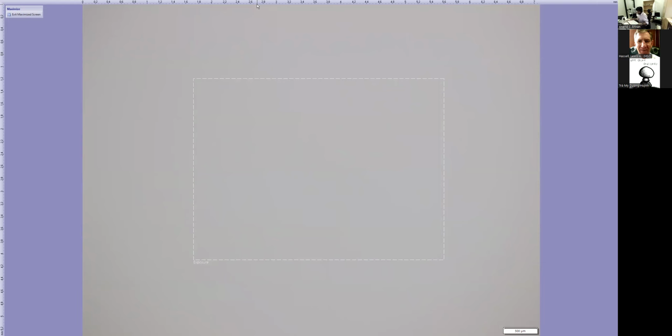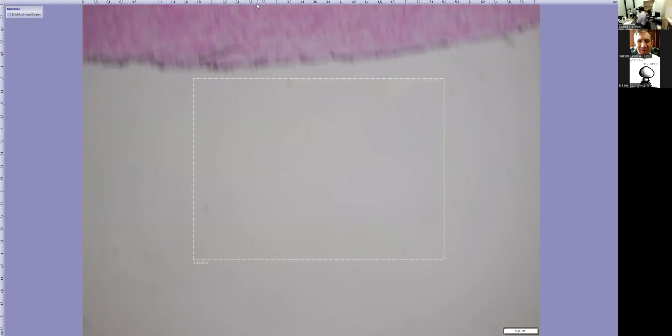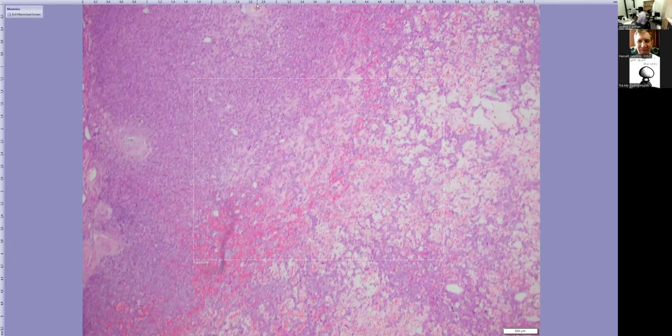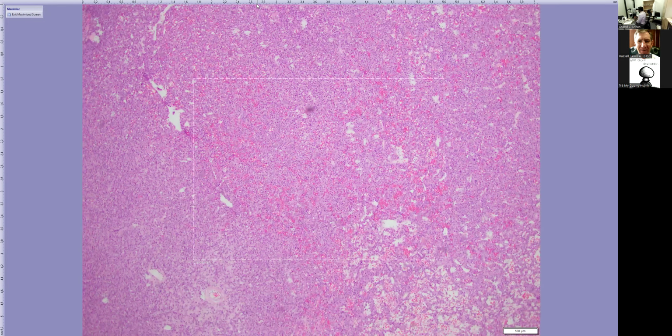So I was kind of stumped at this point. I was thinking of some kind of bland vascular tumor or some kind of tumor with vascular differentiation. So at this point, I didn't have any more markers to test. One differential that I had, although I've never seen a case, was, could this be a so-called rarely described juxtaglomerular cell tumor?